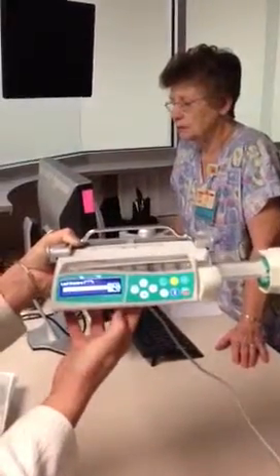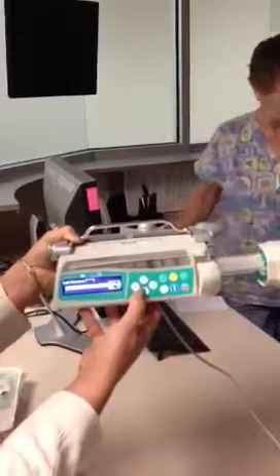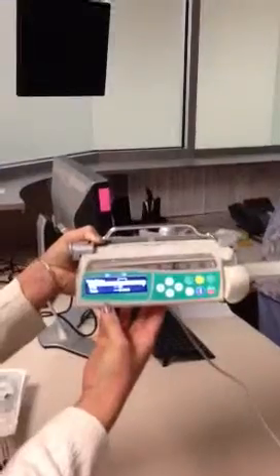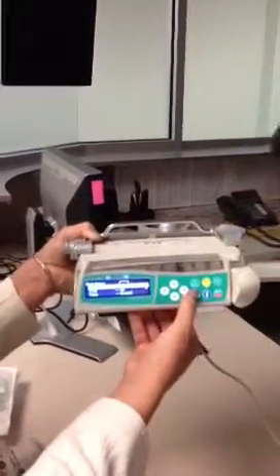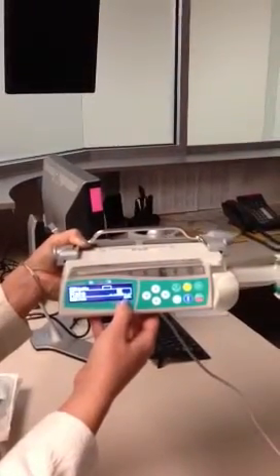It'll ask if you want to use your last therapy — you have the option to revert back. We'll say no, and no is hitting the corresponding down arrow. The next thing highlighted is rate. We're either left arrowing in or pressing OK — we'll select OK. It brings us to our rate screen, where you're going to enter in your milliliters per hour.